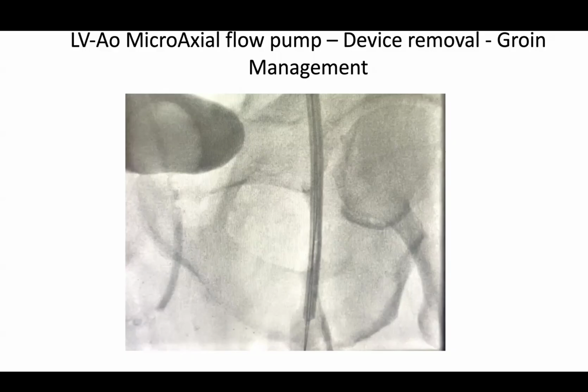So FDA approval for CP is up to 7 days, but if you're still struggling at the first 24 hours, 48 hours, we should talk about upgrade or withdrawal of care, because that's one of the issues they published recently: the golden 24 hours for shock, at least, and the importance of upgrade within 18 to 24 hours.